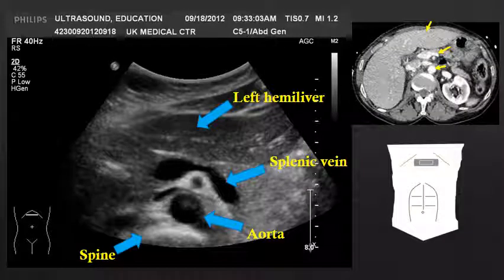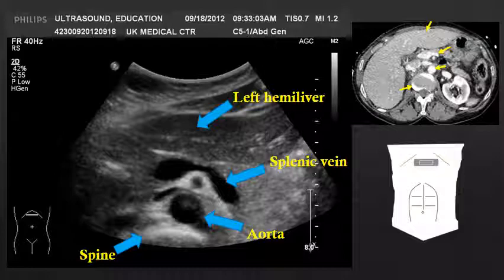The most deep structure in the image is the spine. The spine can be identified by this bright, hyperechoic white line, and it's seen here on CT.